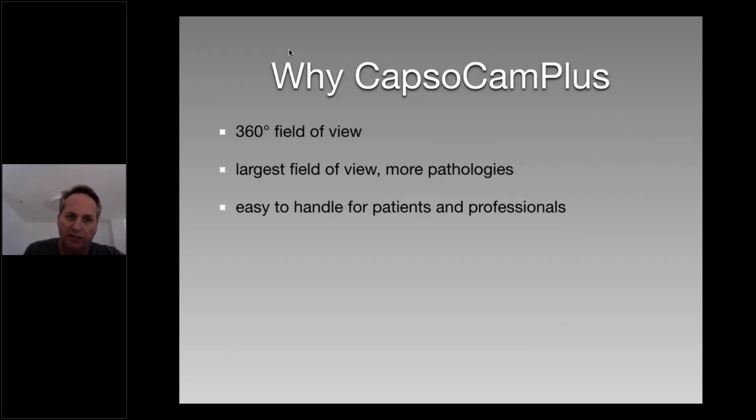Another advantage is it's easy to handle for patients and professionals. So just take a capsule, swallow it, and it will work. You don't have to do any long administration before you can start. Just take the capsule and it's going on.